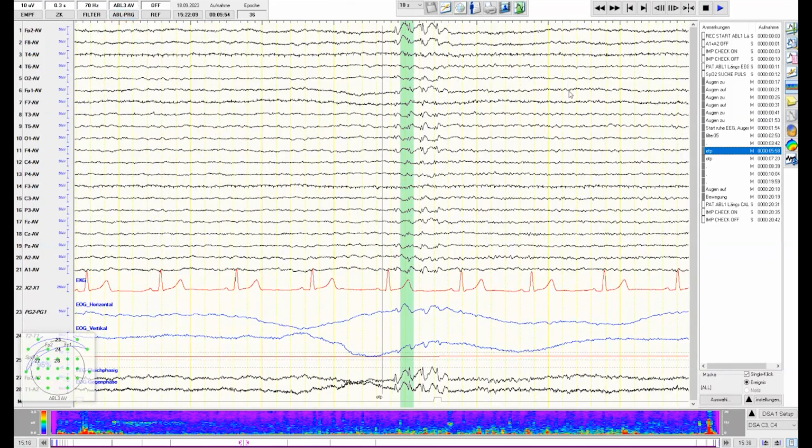And in the end, we had a last EEG. I'm not able to show you today due to time reasons. Again, we increased the Concerta even more, but then more ETPs occurred, and we sent the patient to a neurologist. One could also think about changing medication or implementing some anti-epileptic medication. However, in this case, we seek the help of a neurologist to figure out what medication would be best.